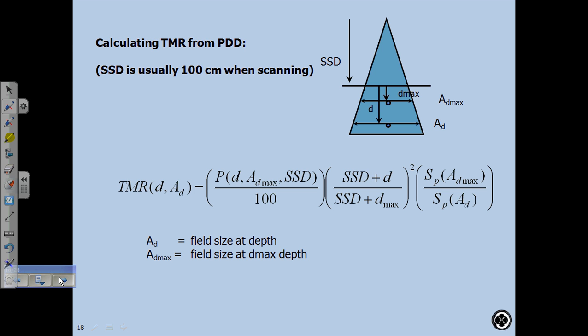There are some automated water tanks where there's a tank, here's the surface of the water, and there's a pump that feeds the water. Okay, and then there's this little rod. This is one system; there are different ways of doing this. There's a rod with a floater, and this floater rides on the rod. It's a magnetic floaty thing, I don't know what to call it. But anyway, based on where that is along the rod, it knows the height of the water.